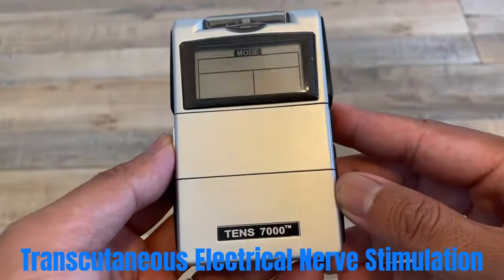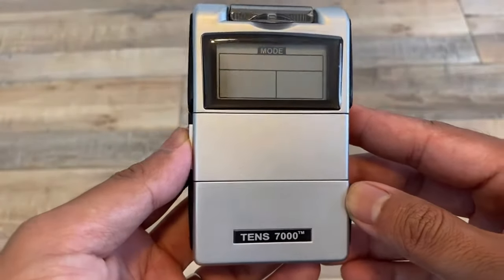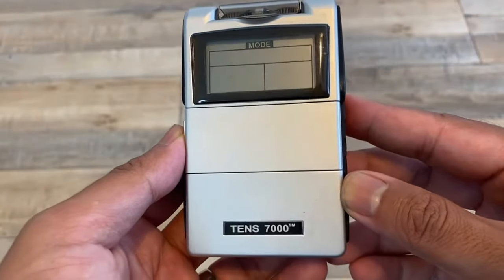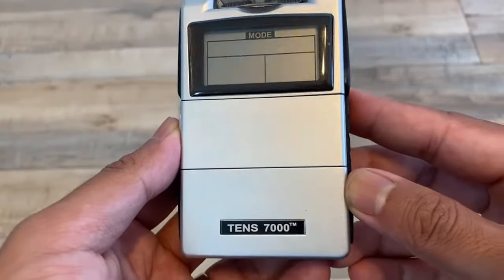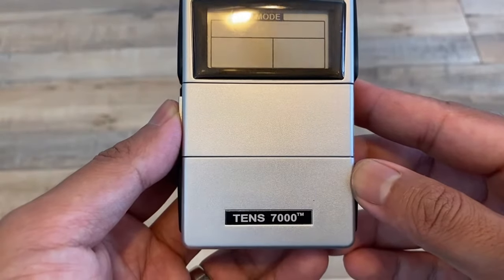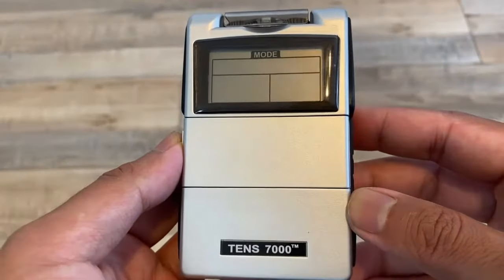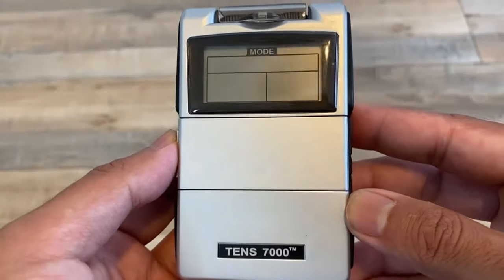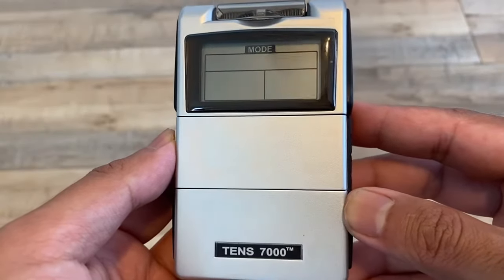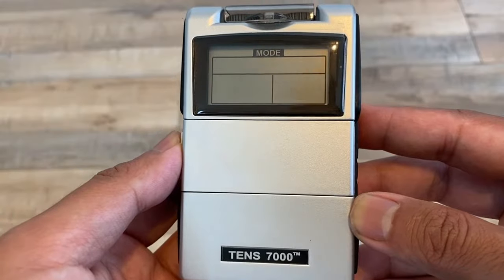I'm going to teach you how to set up the TENS 7000. Just a quick review of what TENS is: transcutaneous electrical nerve stimulation. Why do we use TENS? It's widely used as a non-pharmacological, non-invasive, safe, easy-to-use way to manage pain. The mechanisms of pain control use two mechanisms: the gate theory and the endogenous opioid theory from lecture.